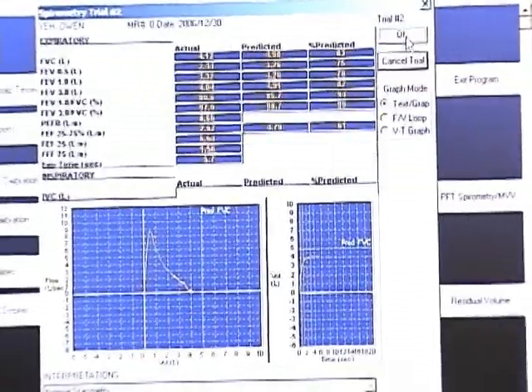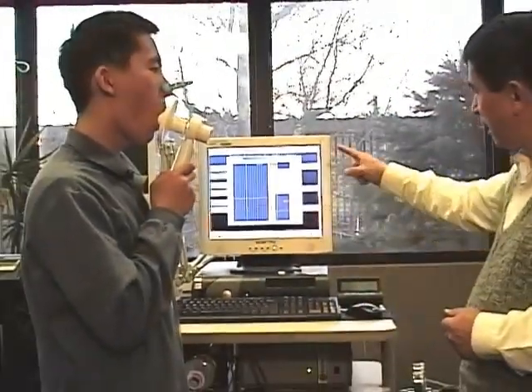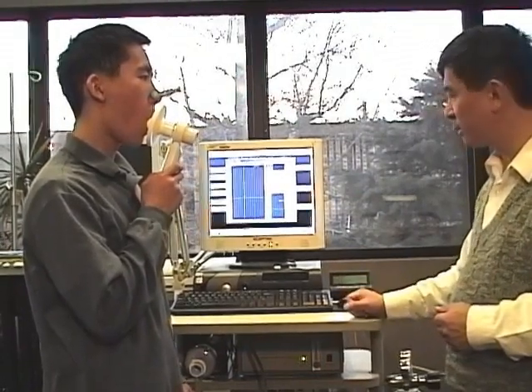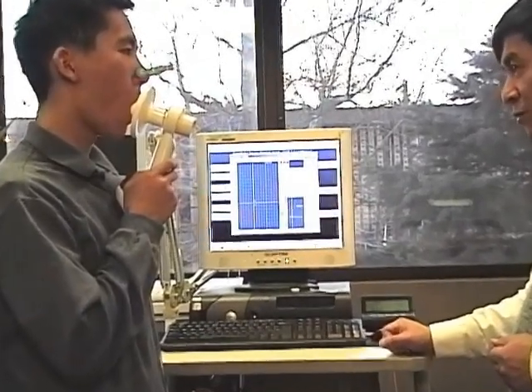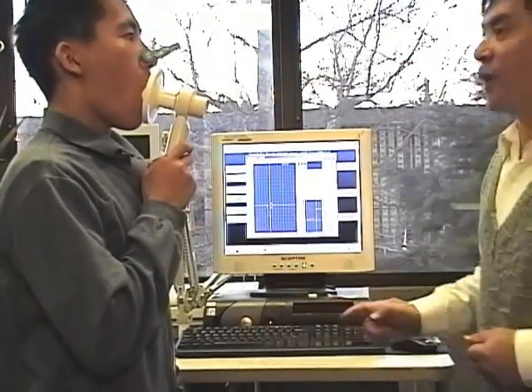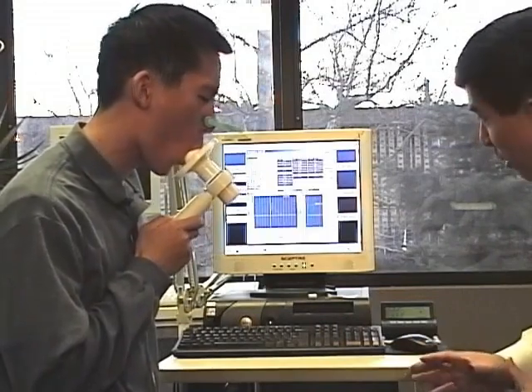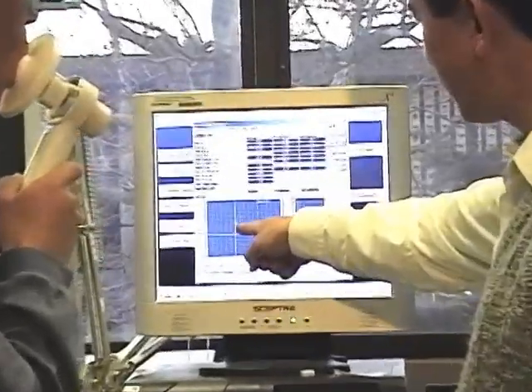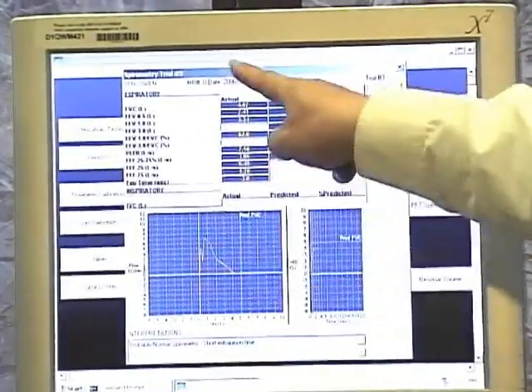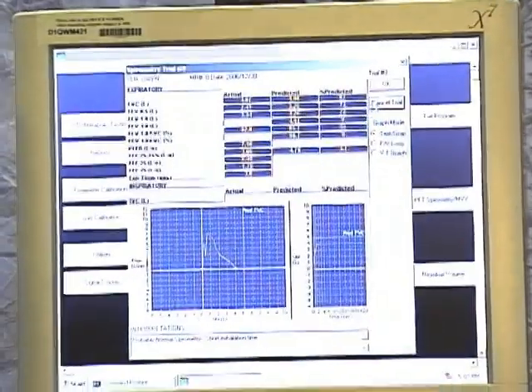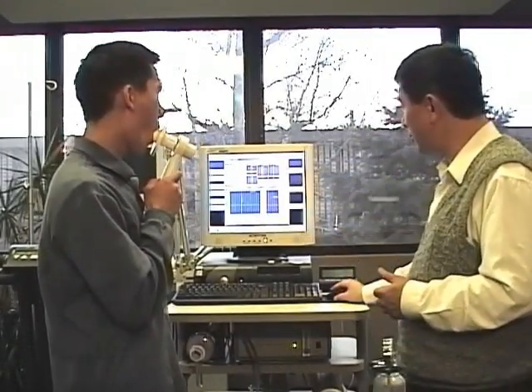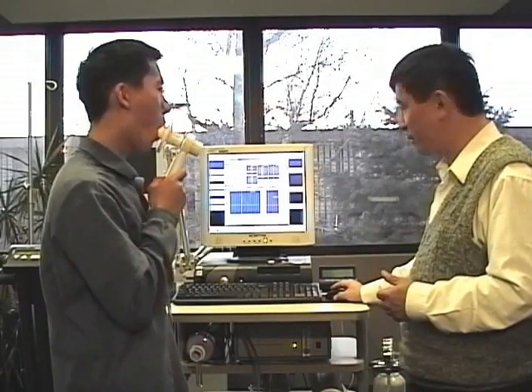For the third trial, take the device again and you'll see the preview screen. After one or two regular breaths, click Start Trial, then inhale big and hold. Exhale as fast as you can — keep going. It didn't go quite successfully. The waveform seems to have a dent where we'd usually see a peak. The exhalation is also a little short, so we'll cancel this trial and do it one more time.